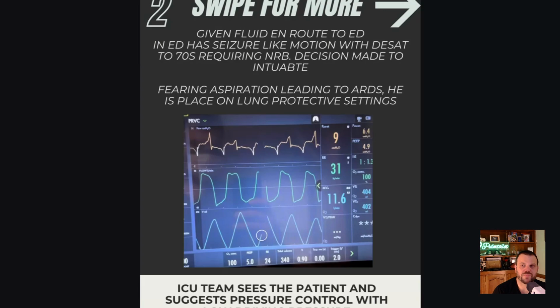But remember, in the passive patient, expiration is completely passive, meaning what you're stuck at as far as a rate goes is dictated by your time constant. So if you intubate a patient with severe metabolic acidosis and they're paralyzed, you can't just make the rate 30 and the volume 500 because you have to try to match what they were doing pre-intubation. That's not going to work, because your rate's going to be too high at some point based on the mechanics, based on the time constant.